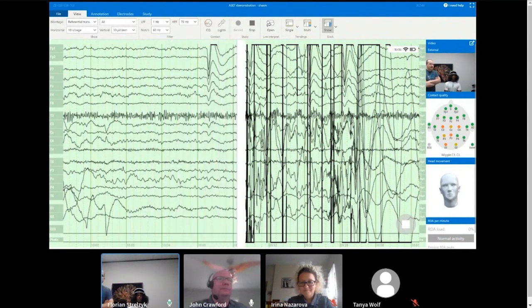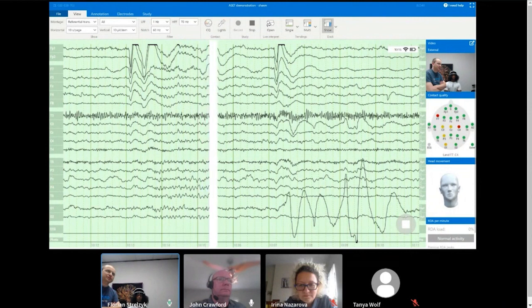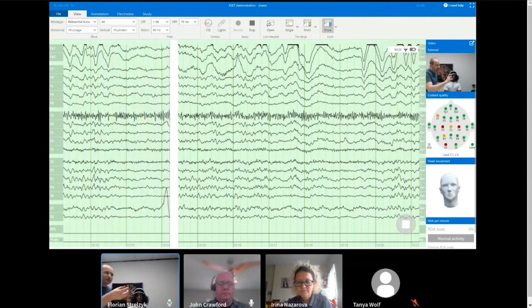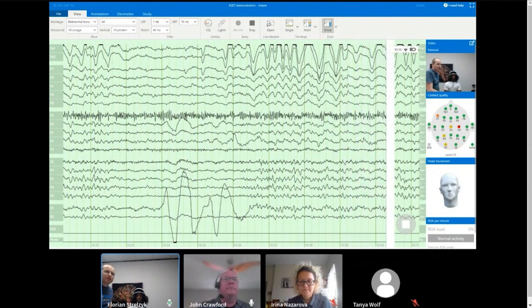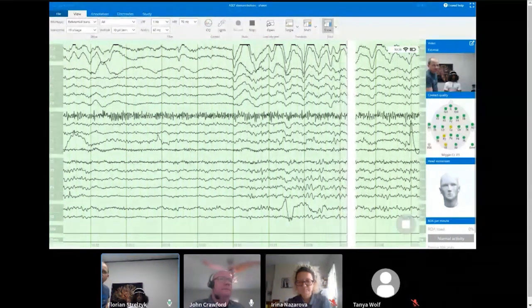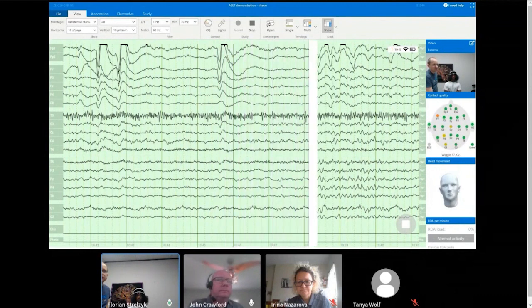So I think the situation here, you see FC is green, CZ is going to turn green in a moment, PZ just turned green. So I think with this particular recording, the electrodes will settle on their own, probably better than me messing with them. Because whenever you mess with the electrodes, you kind of restart this entire settling process on the skin electrode interface. You see we're now down to maybe 3-4 electrodes, but anything yellow is, we are just indicating that there is a little bit more to close the gap, but usually yellow is good enough to start the read. And you see, as we're just waiting here, these channels are turning green on their own.